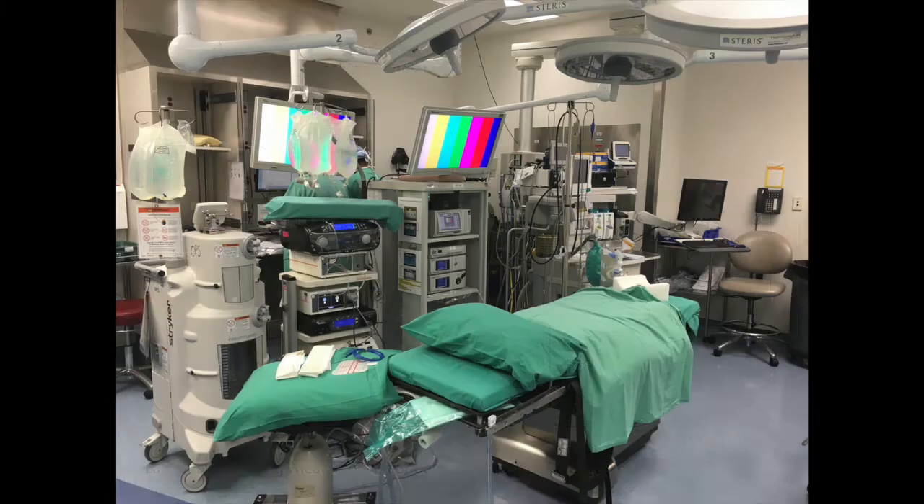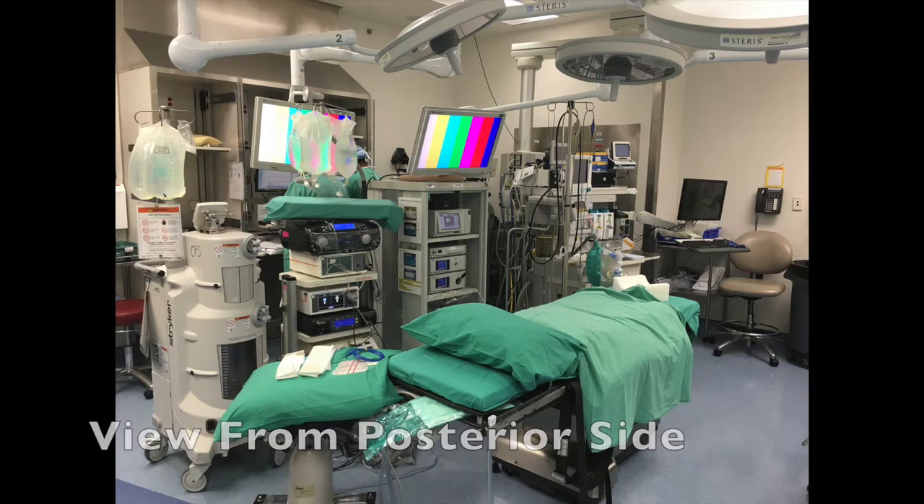At our institution, a standard Steris AMSCO surgical ortho-vision operating table is used.